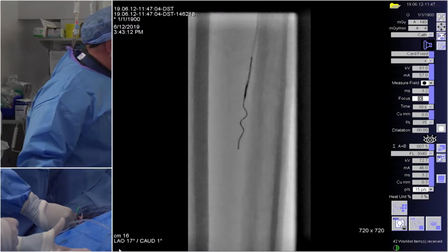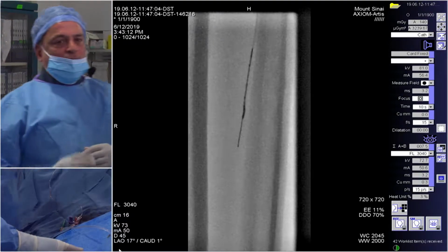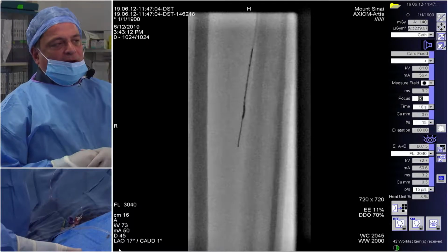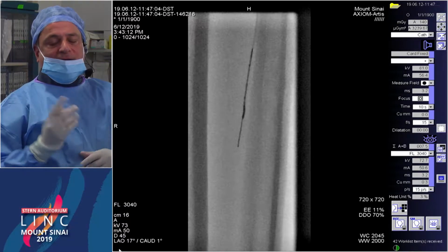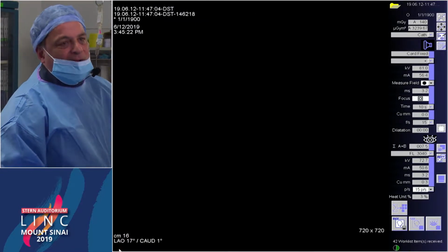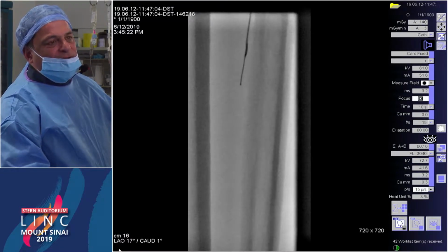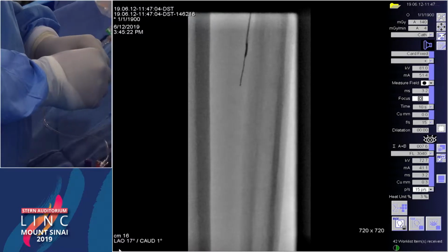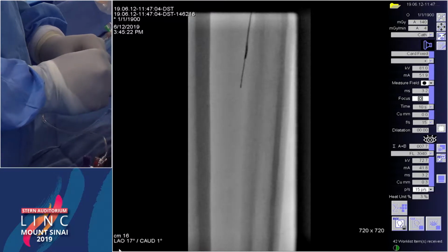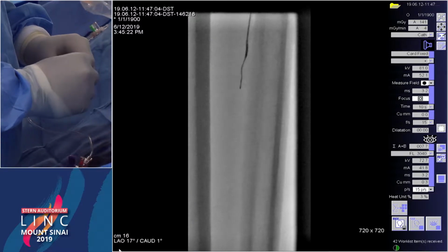You know what we do, Fadi? In our hands, we always want to give one attempt at antegrade failure. I mean, I think you're right. We could. It is like Stephen said in the other case, it's not a horrible toe ulcer, but it's a chronic painful ulcer that this poor lady has. So to me, the entire foot is alive with that small little vessel. So without giving a rapid go here with an antegrade approach, I don't know if it's prudent to just go to the retrograde.